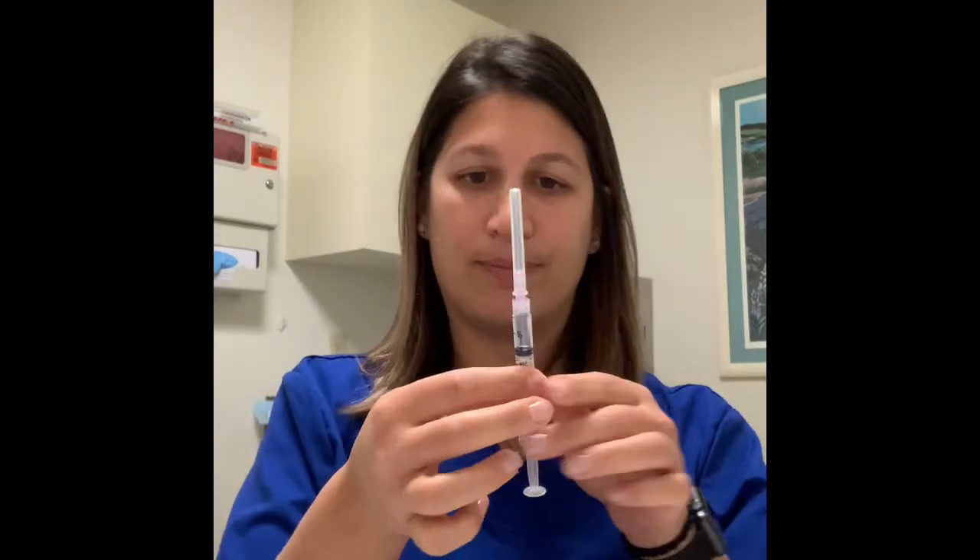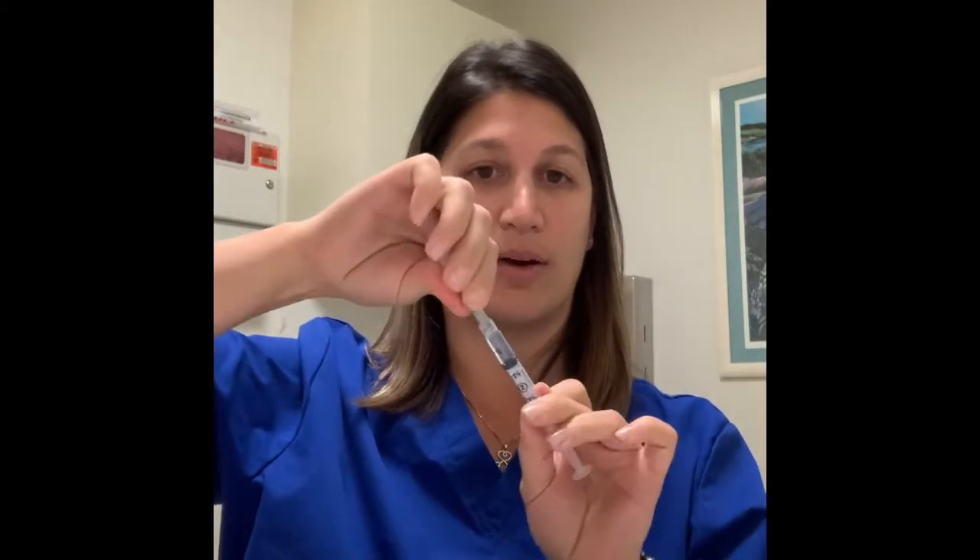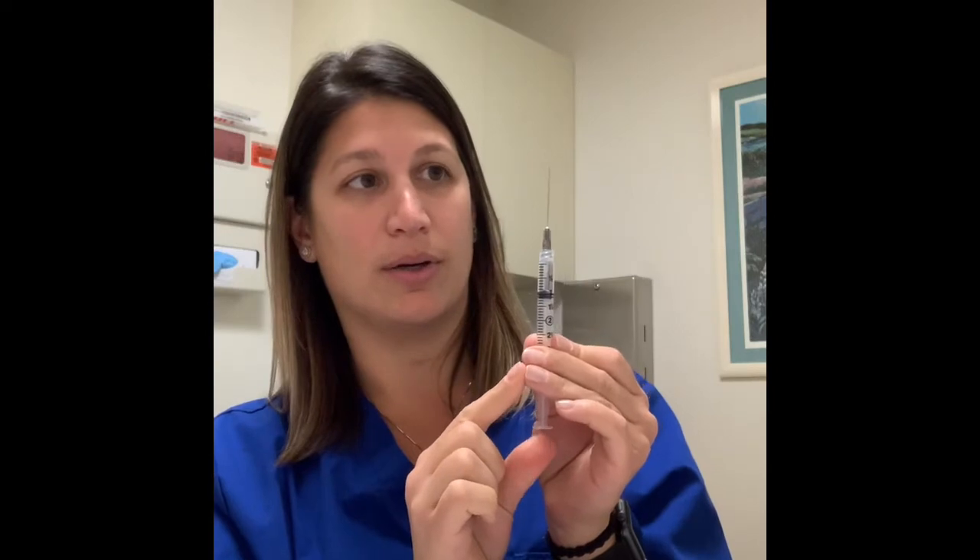Carefully recap the needle — you can scoop it up on a table — and then twist that larger drawing needle off. The pink-hub needle is never going into your body. Take one of the dark gray hub 22 gauge needles and twist that one on. Remove the safety cap and, just like with your Menopur, push up slowly until you get a small bead of fluid at the tip of the needle — it's primed and ready to go.